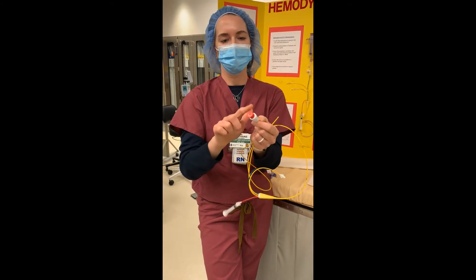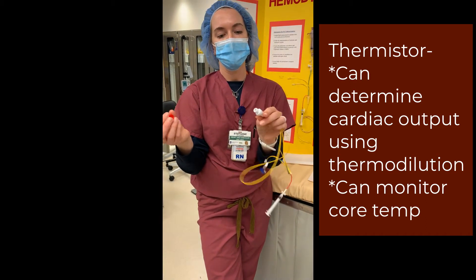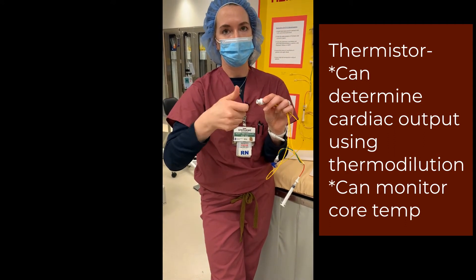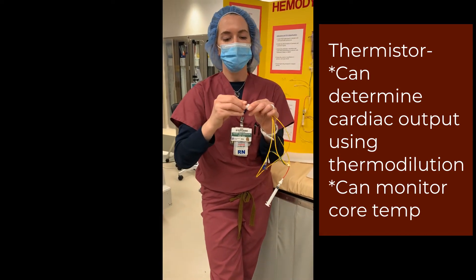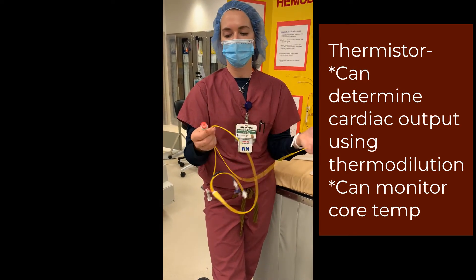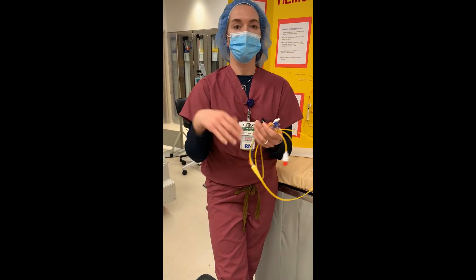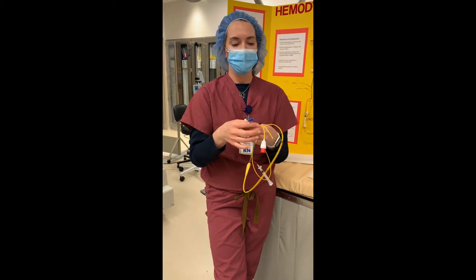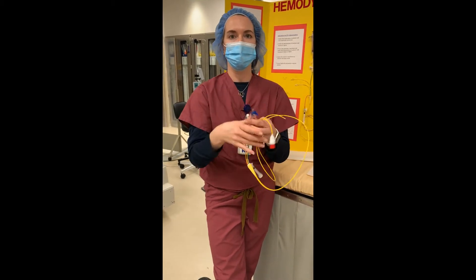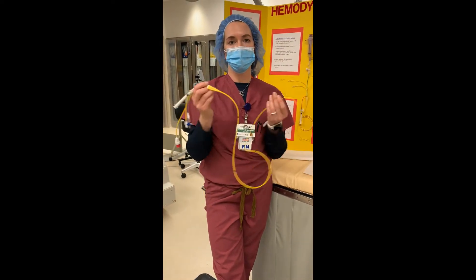The other part of this catheter is the thermistor. You'll take the red cap off — it may already be off when the patient arrives upstairs — and attach it to the thermistor connection on your monitor. It's a small round connection that you screw in. That's going to give you a continuous core body temperature. When we're ready to take measurements such as a thermodilution for cardiac output, we use an outside and inside measurement to get the cardiac output.